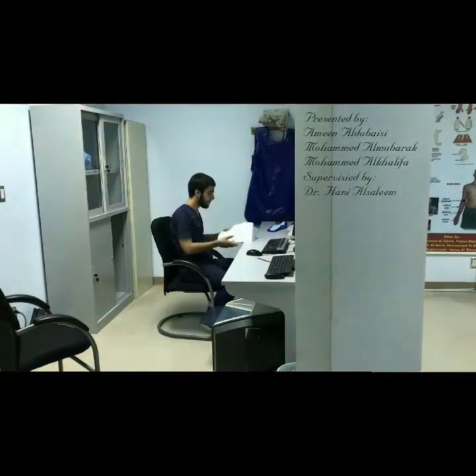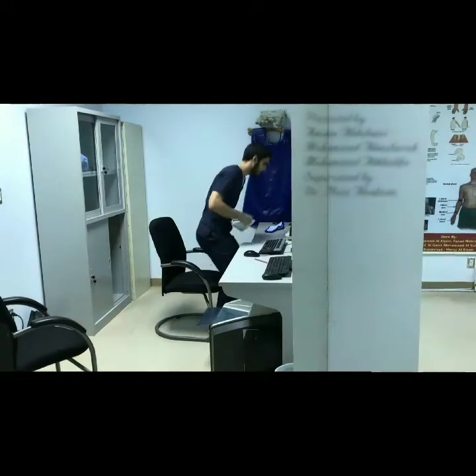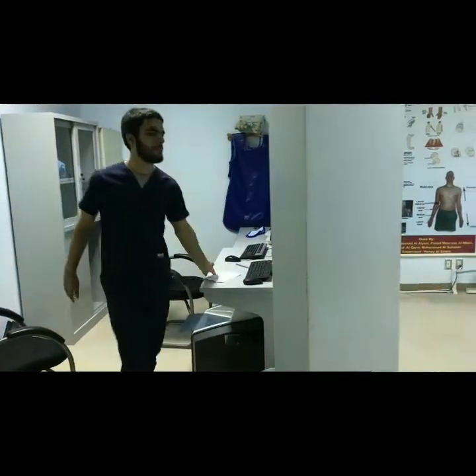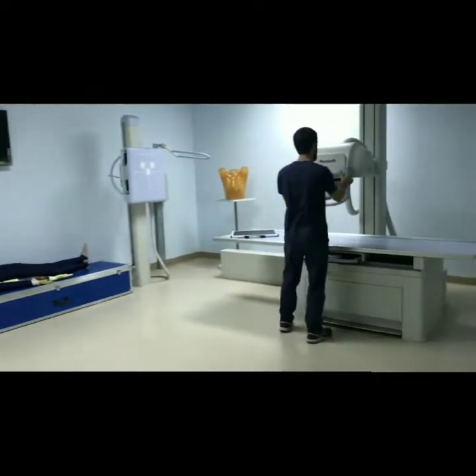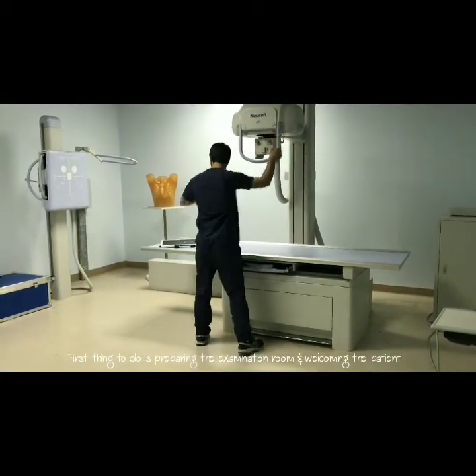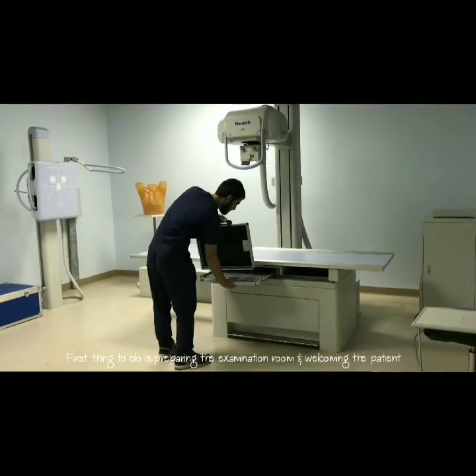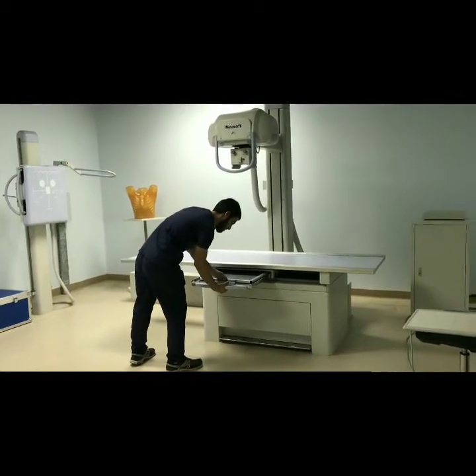Welcome to the x-ray department. This morning the radiographer receives his first case in which he is expected to perform the non-traumatic routine projections for both sacrum and coccyx on a middle-aged male. Before the patient comes in, always prepare the x-ray machine in advance to be time efficient. Raise the x-ray tube and insert the imaging plate in Bucky beforehand because you already know all required projections prior.